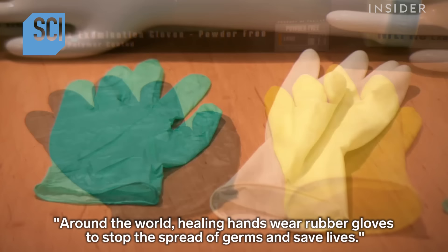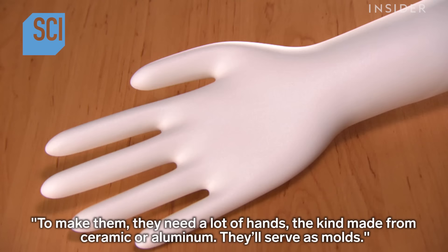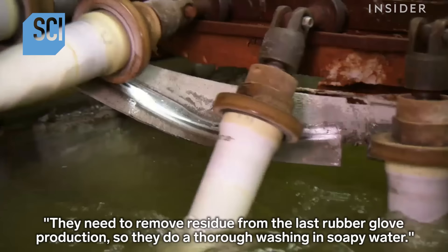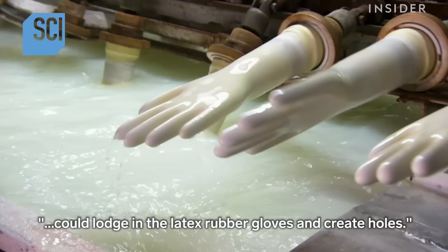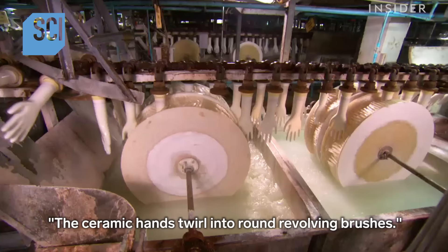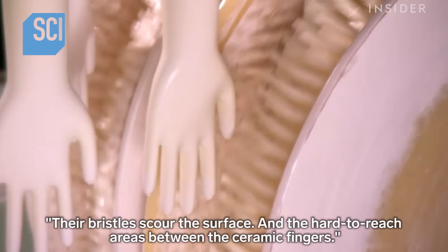Around the world, healing hands wear rubber gloves to stop the spread of germs and save lives. To make them, they need a lot of hands — the kind made from ceramic or aluminum — which serve as molds. They need to remove residue from the last rubber glove production, so they do a thorough washing in soapy water and then in bleach. They must remove every speck of residue because even the smallest contaminant could create holes in the latex rubber gloves.